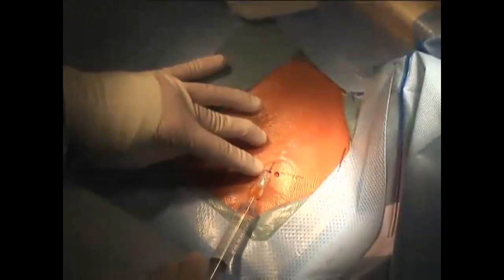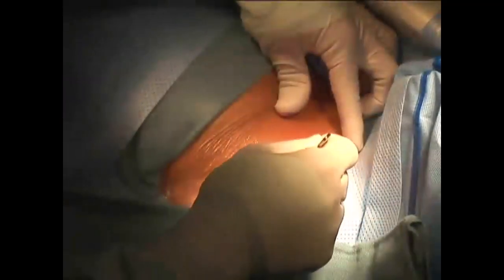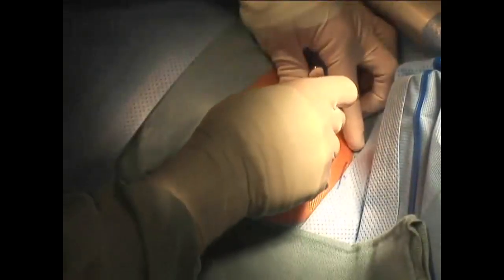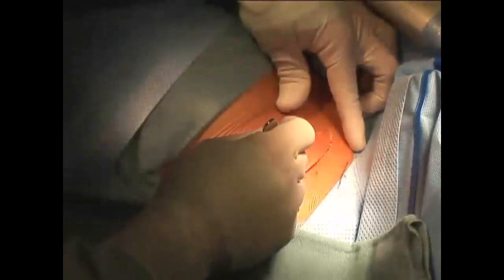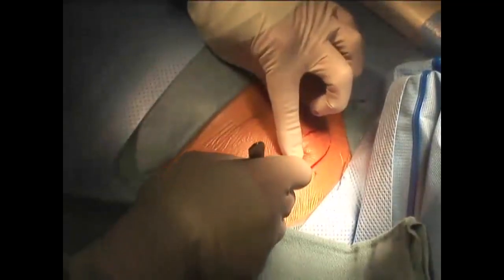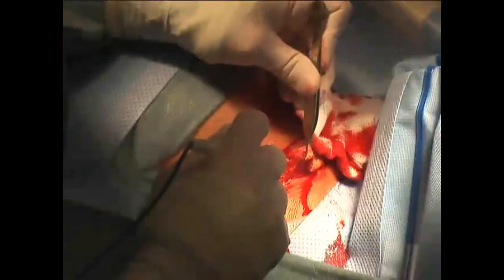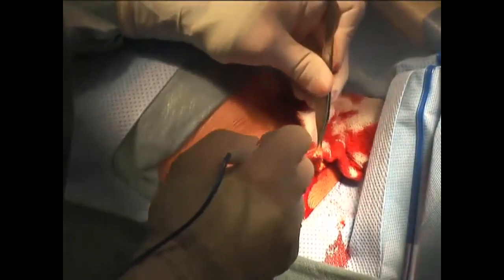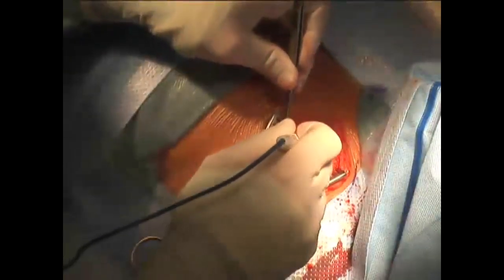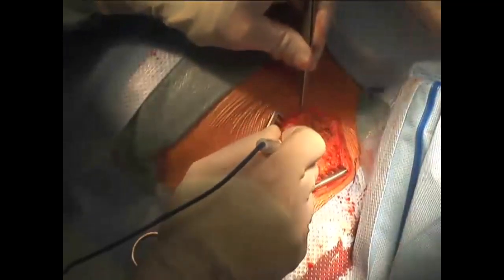Lidocaine is used for local anesthesia. An incision is made with a scalpel. This patient desired removal of a hypertrophic scar, so an elliptical incision is made surrounding the scar. All bleeding is cauterized as the hypertrophic scar is removed. A Weitlaner retractor is placed, and using electrocautery, dissection is carried down to the ICD pocket.